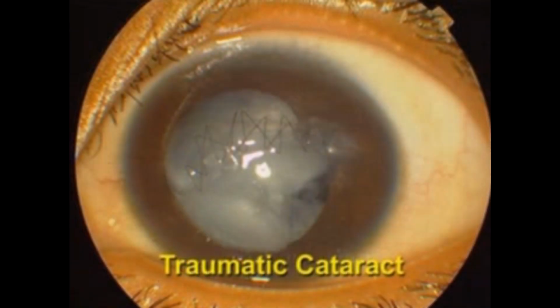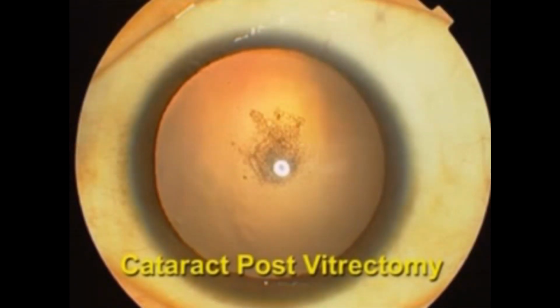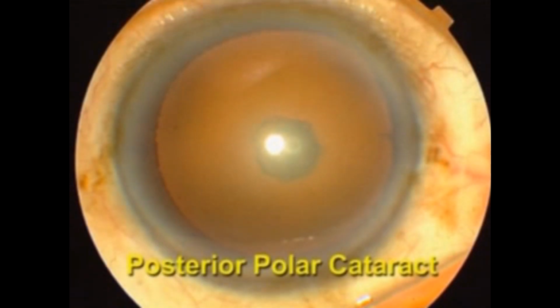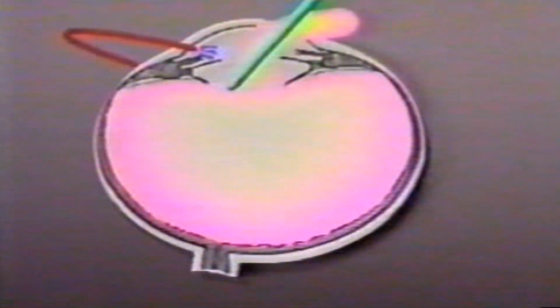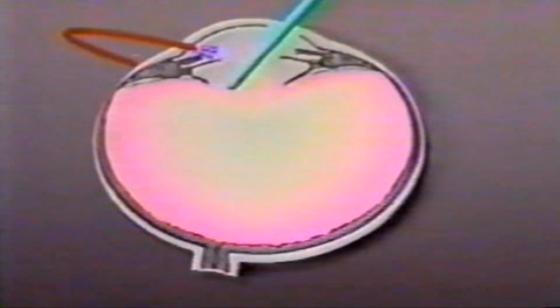Anticipate PCR in a patient with traumatic cataract, cataract post-vitrectomy, posterior polar cataract, hard brown cataract, cataract with pseudoexfoliation, etc. In this animation, you can see the vitreous acts like a slinky. When there is a posterior capsule rupture, when there is a coaxial irrigation aspiration, which means that irrigation and aspiration are the same port, there can be an extension or enlargement of the posterior capsule rupture and more hydration of the vitreous, and more vitreous will start coming into the anterior chamber.